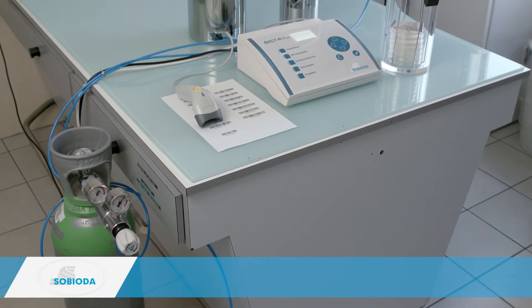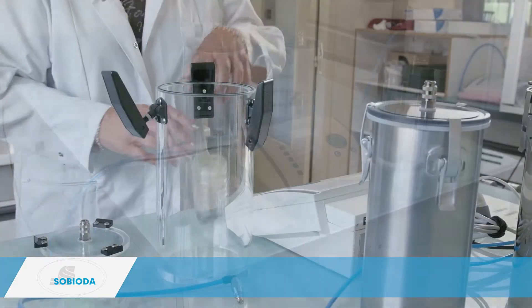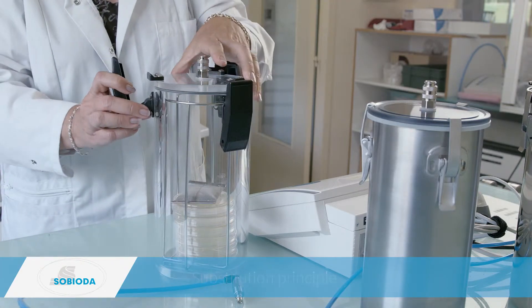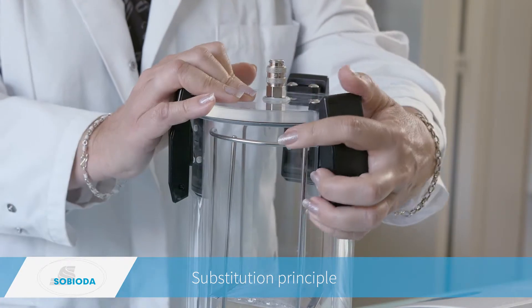BACDAR Plus operates according to the substitution principle. The device removes the air from the jar and replaces it with a specific gas mixture. The simplicity and ergonomics of the device allow direct access to all the programs, including the quality tests.